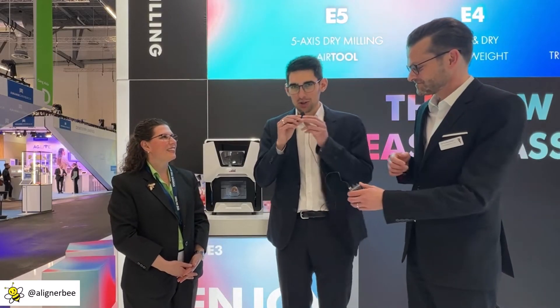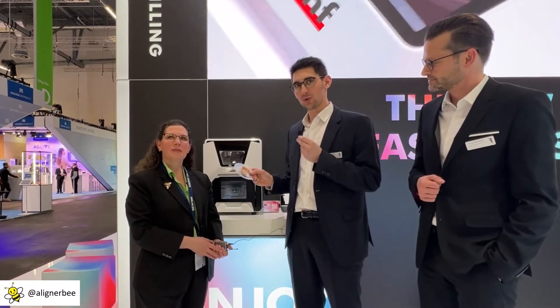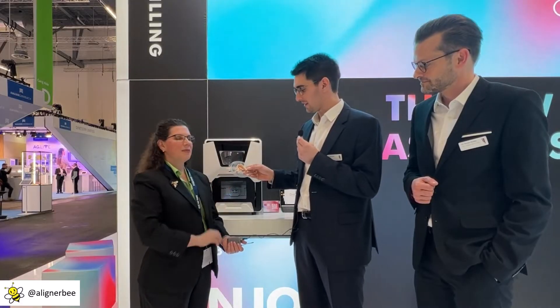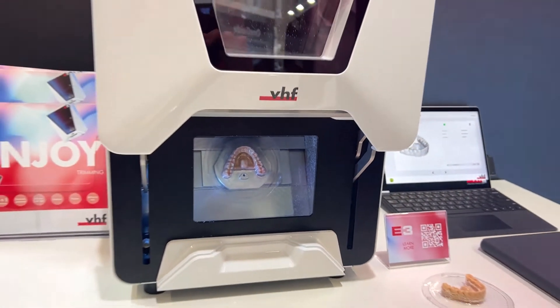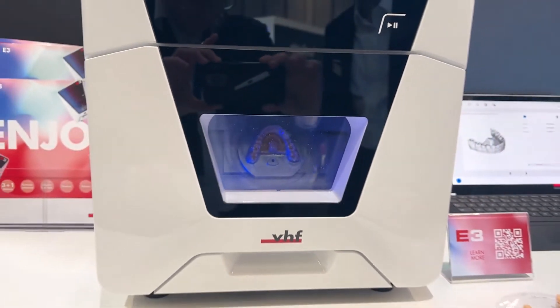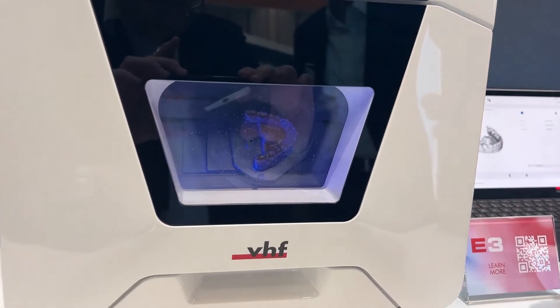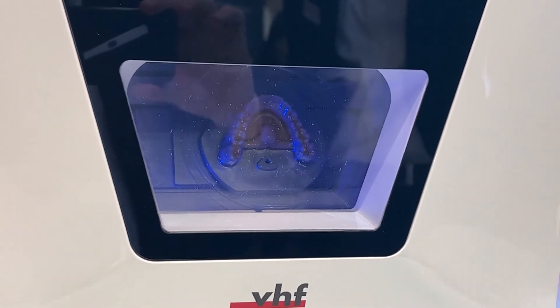Let me show you the ease-of-use features of the E3. We have a system for tool-less insertion of the blank — the model itself. You just take it, insert it, that's it. Close the door and start the milling job with the start icon. After 45 seconds, we see a great result of our trimmed aligner.